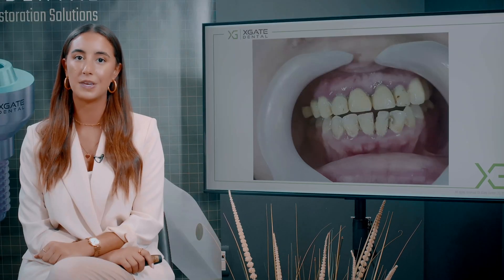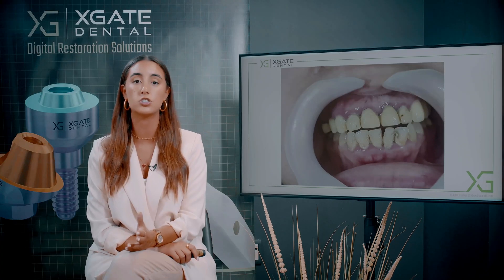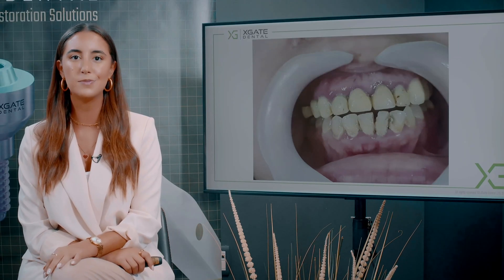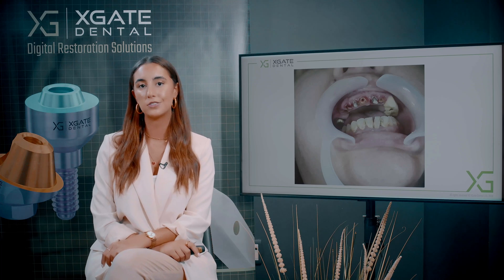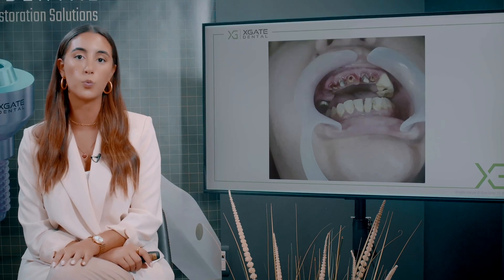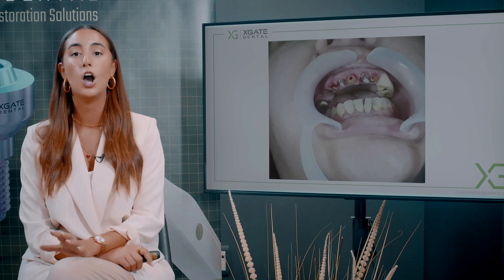Doing it step by step is in some cases even easier for the patient — psychologically you change some of the teeth and they're left with some other teeth, without bleeding pain all over the mouth. Sometimes you want to change everything at once, sometimes you want to do it periodically. You can see that three teeth remained. Those other teeth were extracted. The teeth that remained had root canal treatment and post and core were cemented to them for the temporary bridge to have better retention.